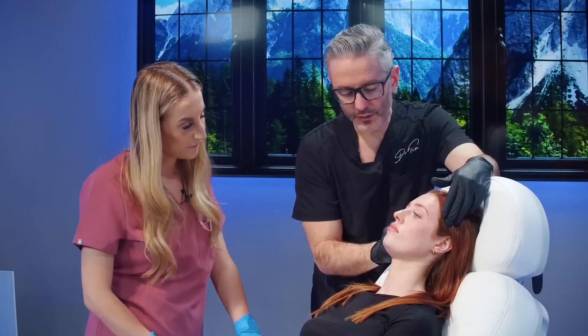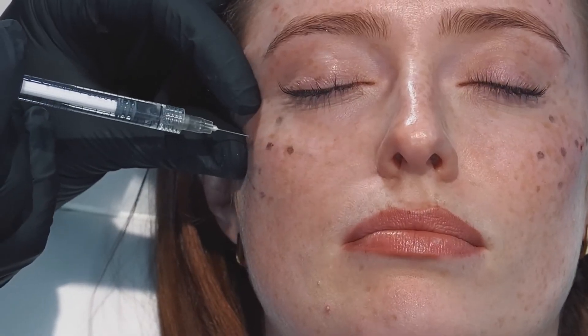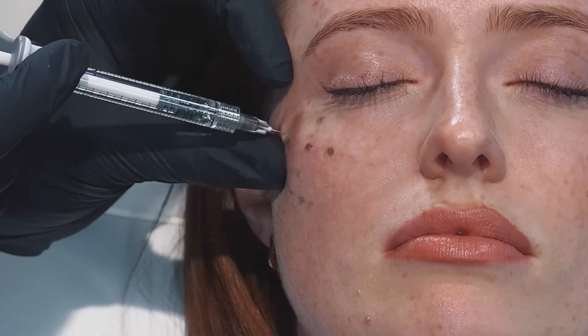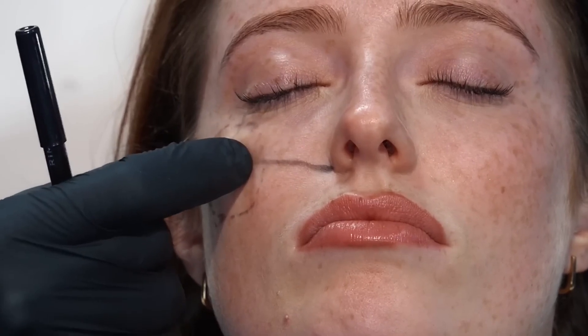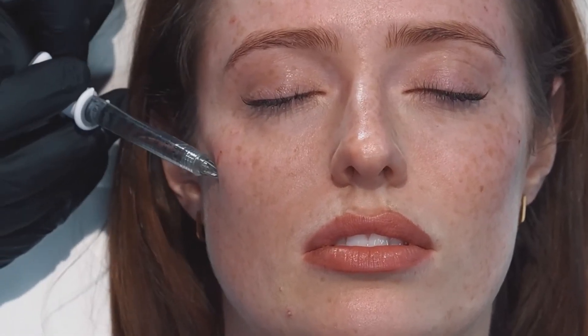Getting back over here, there's less certainty about what happens with the product - some studies suggest it all spreads above and below. But up to this point, there's typically another weak point. The goal is that the cheek should form a round shape - like a teardrop, or a spoon where the deepest part is the area of greatest definition and then it fades away. If you just do those injections, you can end up with an empty spoon that creates too much definition, so quite often you need a little bit of volume there as well. I usually make that decision as I'm treating.